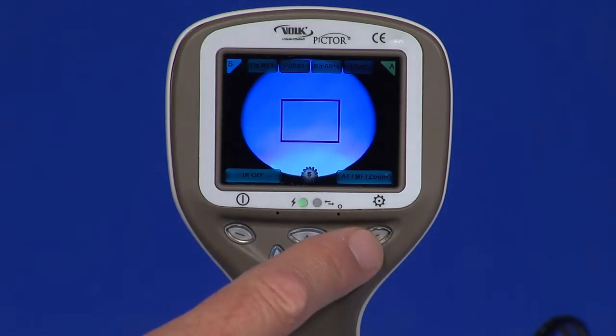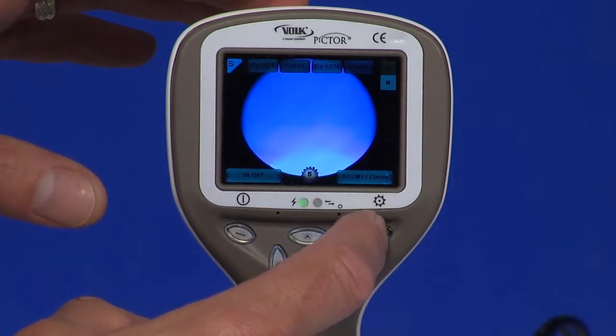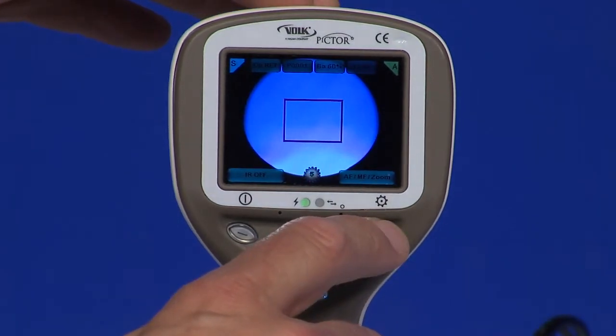Right soft key. There are two functions for the right soft key. Switch between auto and manual focus modes. Auto focus range is minus 11 to plus 3 diopters. Manual focus range is minus 20 to plus 20 diopters. Enter the camera menu by pressing the right soft key for longer than 1 second.